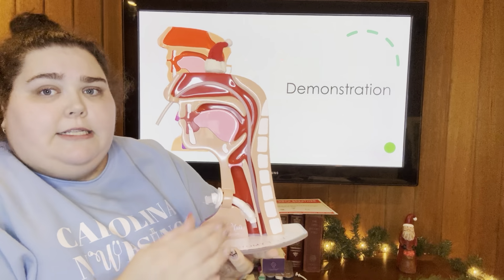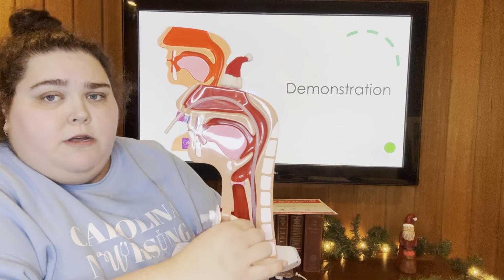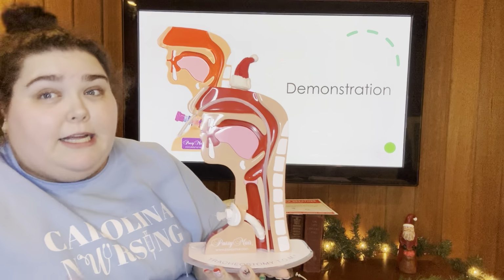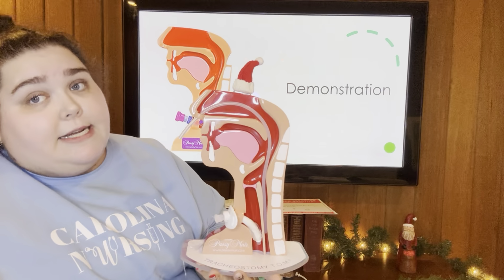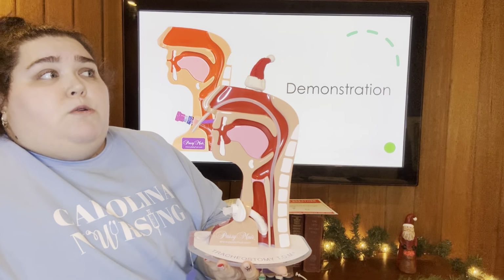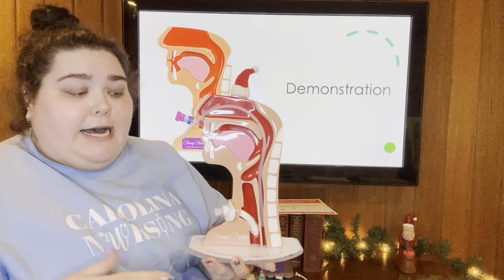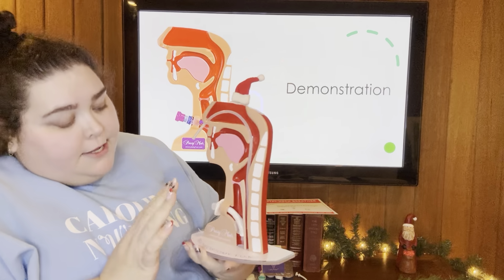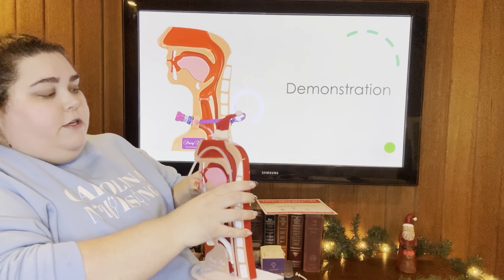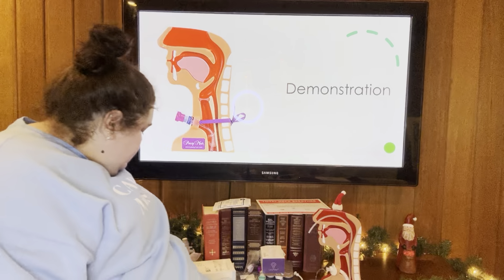So the trach sits here in the airway. You can see that it's got some room to wiggle. We don't want the trach to be butting up on the sides of the airway, so we can downsize it if we need to and upsize it if we need to. Most Shileys come in size 4, 6, and 8, so there's some wiggle room in size. This is a size 6 that Tom has on currently. So that's the anatomy of the trach. We'll put him down for right this second.